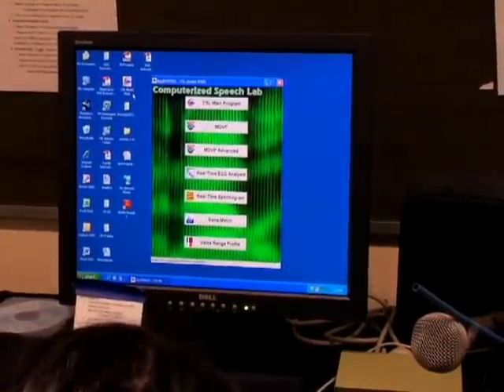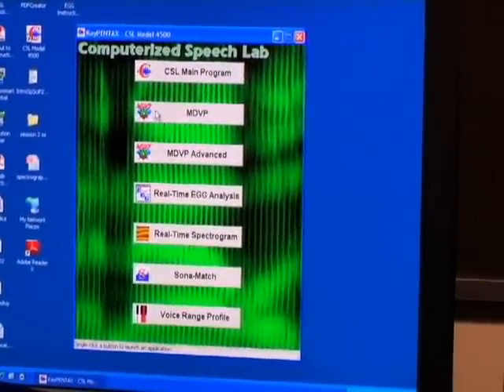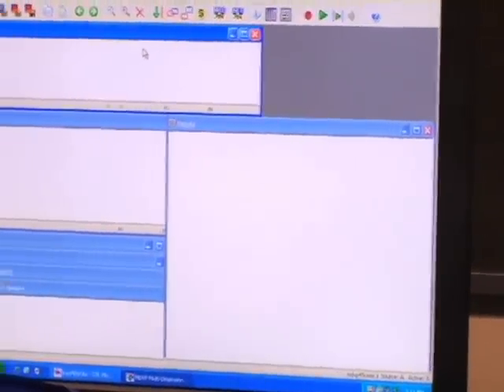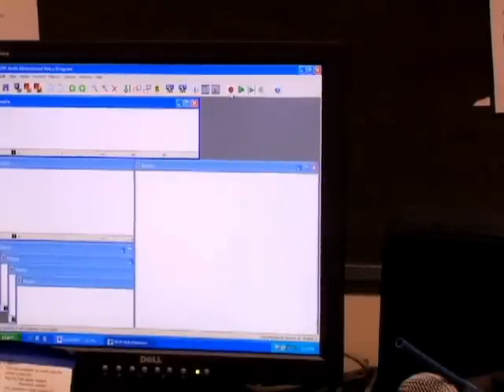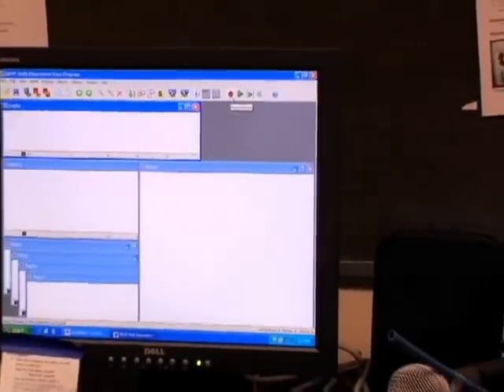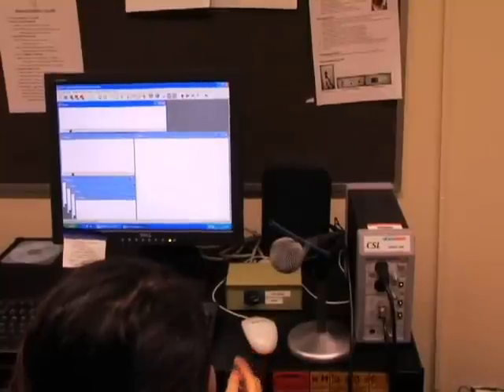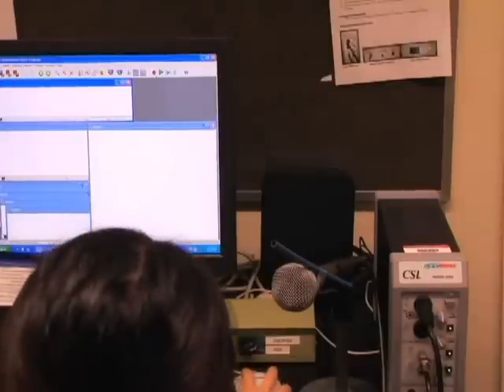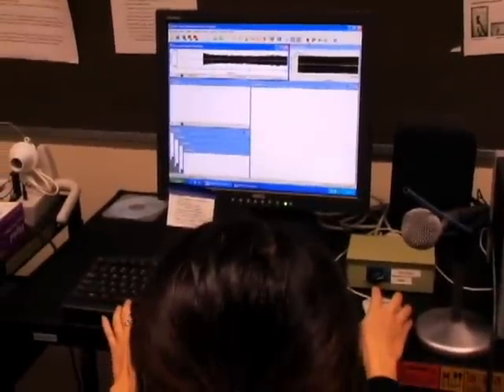A window with different program options will pop up on the screen. Click on MDVP. This will take you to a screen with many blank windows. Click on the top window on the upper left of the screen. Now you're ready to record. Click the red button located at the top right of the screen. Speak AH into the microphone for at least 3 consecutive seconds. For most accurate results your mouth should be 5 cm away from the microphone. Notice we have added the straw for accurate measurement. Keep your finger on or near the spacebar on the keyboard to stop recording once an adequate sample is collected.